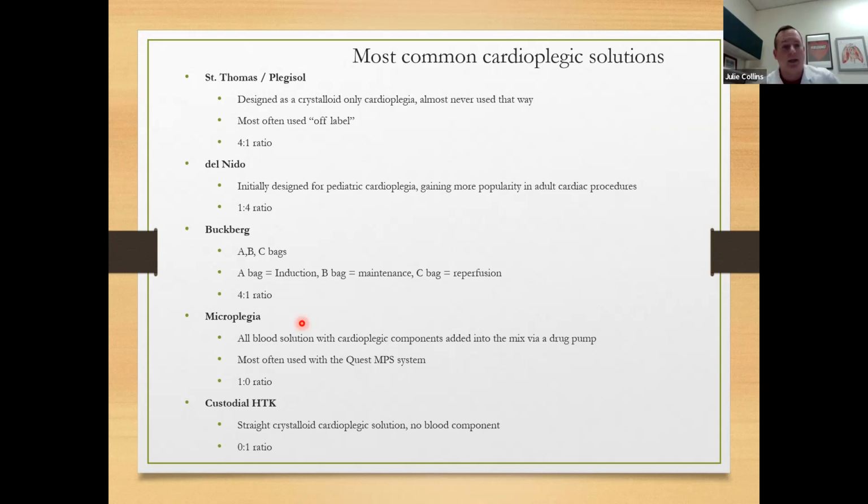So I actually think the solutions that have more hemodilution have better microcirculatory flow in the myocardium. And I think that's why Del Nido has been a very effective cardioplegia, because you think you're doing good things by giving a very high hematocrit, low dilution type of solution, but you're potentially just sludging things up.